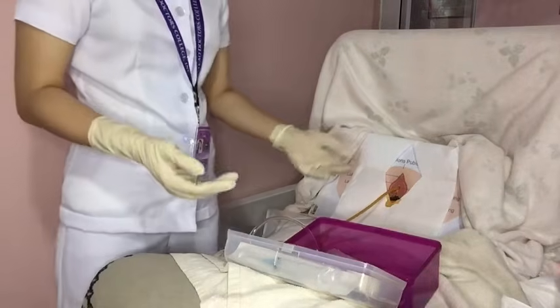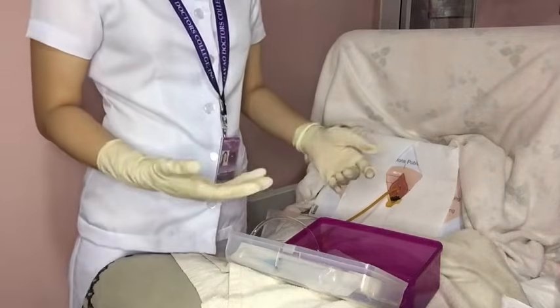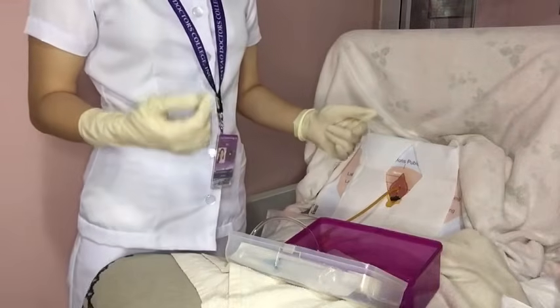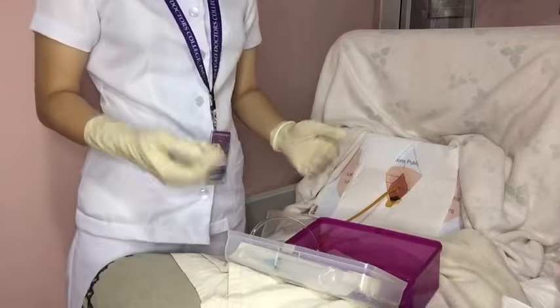Now let's inflate the balloon with 10 to 15 cc of sterile water using a 15 to 20 cc syringe. Then secure the indwelling catheter by taping it to the patient's thigh, and allow some slack in the tubing to accommodate the patient's movement.